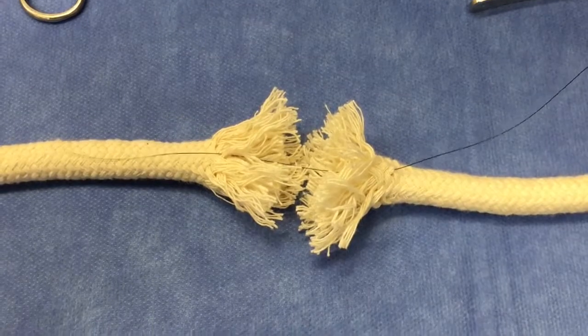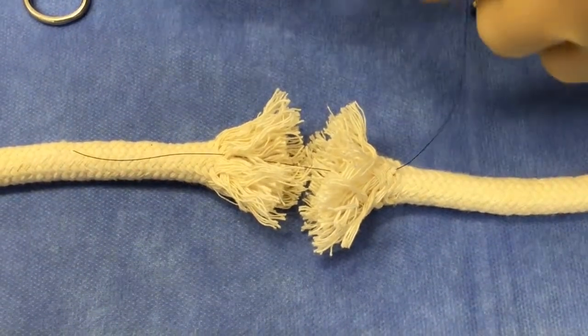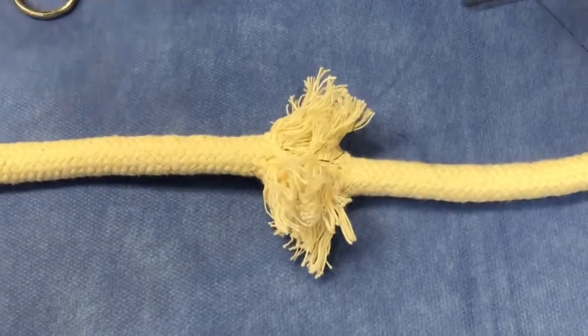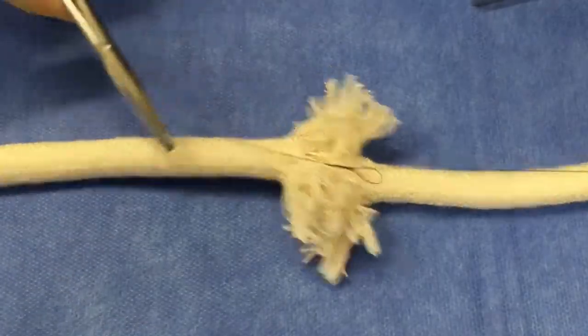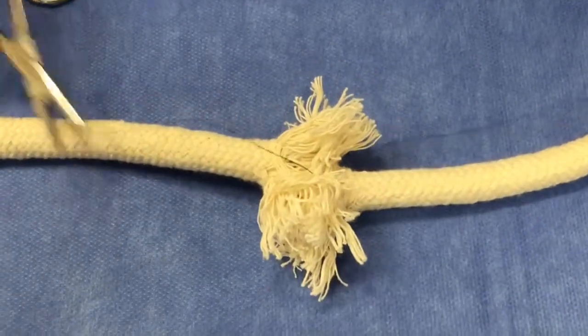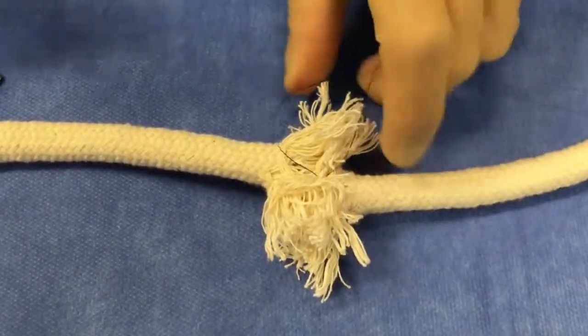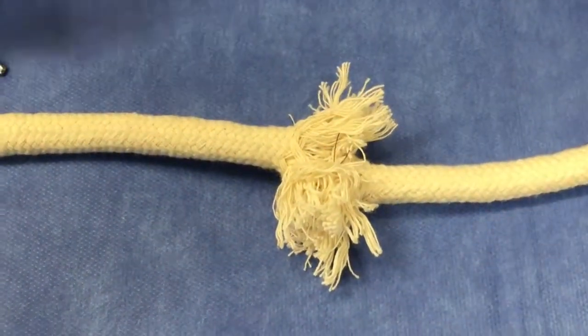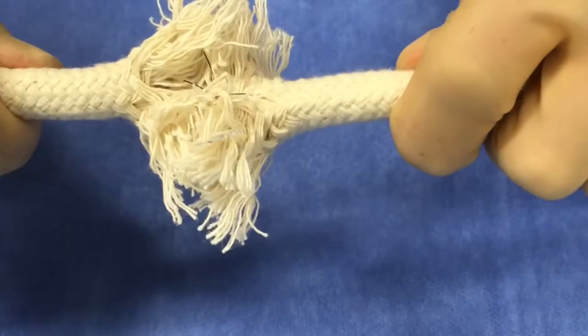Well, here's an example of what happens if we try to take the ends of a lacerated extensor tendon together using a simple interrupted suture, something we're all familiar with. The problem here is the ends of a tendon, much like this model rope that I'm using, tend to get very frayed. And when you try to suture something that's frayed like this, it's just not going to hold. It's going to rip literally right through those strands of the tendon.